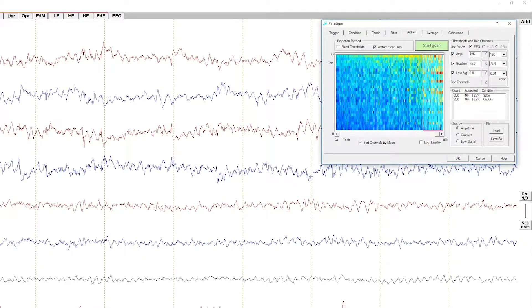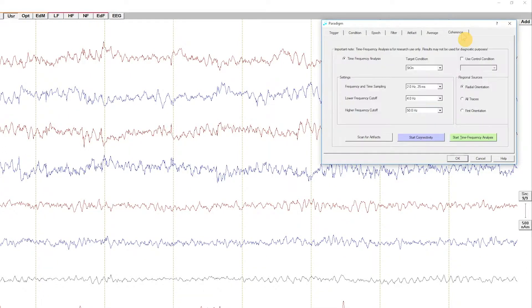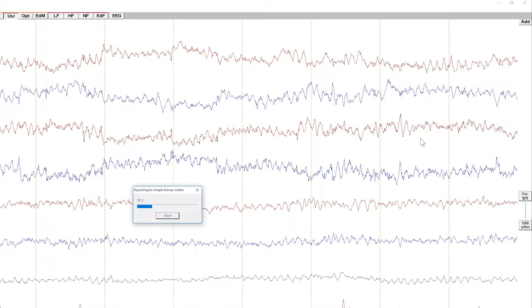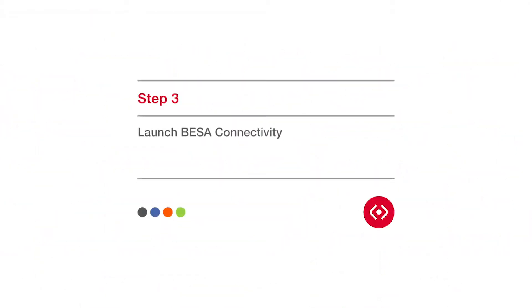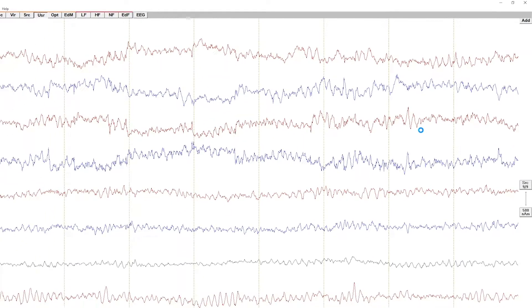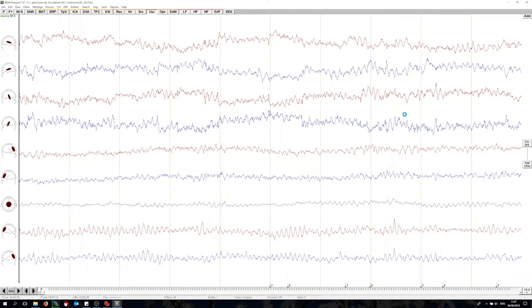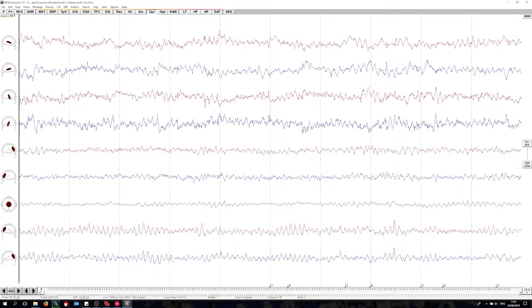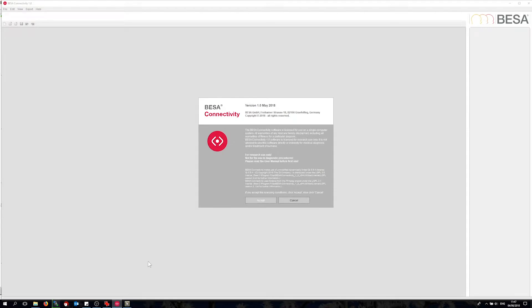Now go to the coherence tab. I'm going to start my condition of interest here, which is the stimulus-on condition. Then I simply press the start connectivity button. This now exports the epoch data to a simple binary format and then starts BISA connectivity. Let me bring up the icon and press the accept button.